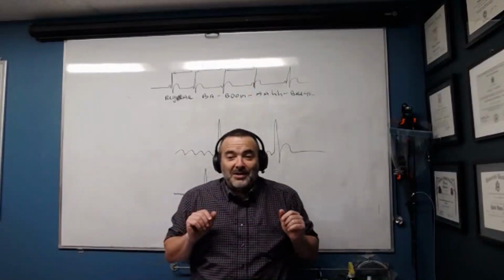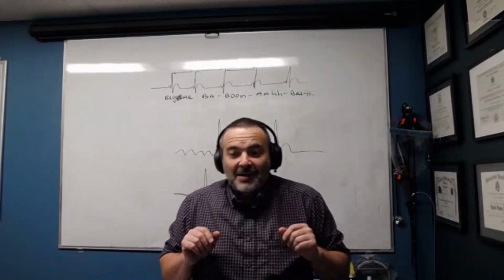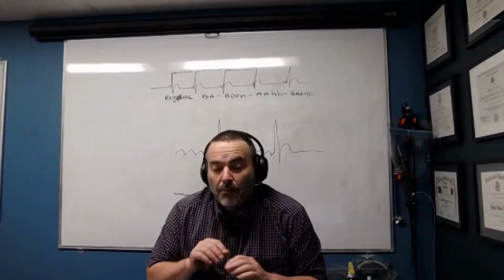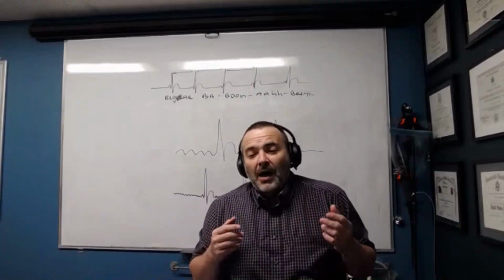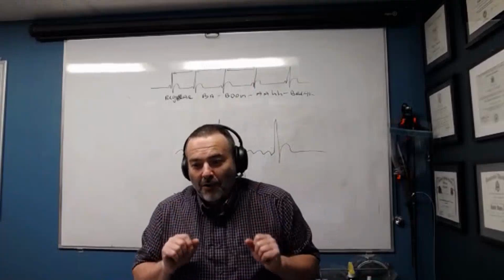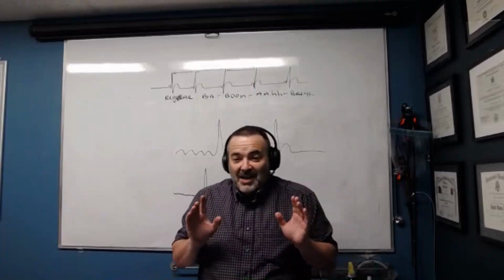But this is the secret to understanding rhythms of the heart: singing it out and comparing it to ba-boom, break, ba-boom, break. Everything else is just plain wrong. All right, I'm going to stop right here.